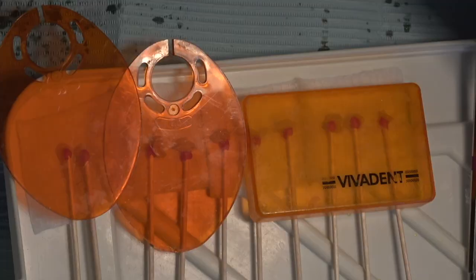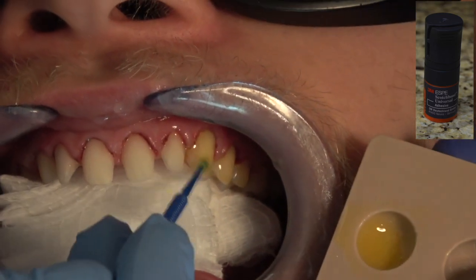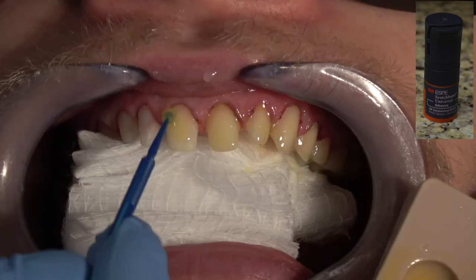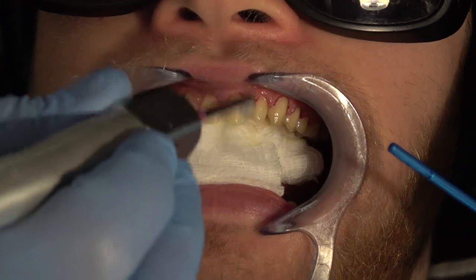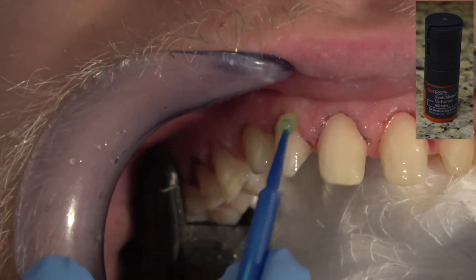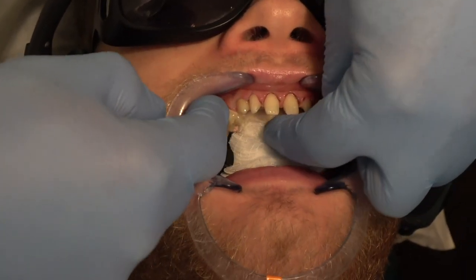Now, I've dabbed the teeth with a 2x2. The primer adhesive likes dampness. The primer is attracted to water. It's hydrophilic. So you don't have to blow them dead dry. Just kind of dab them off with a 2x2. You don't want to elicit bleeding again. And pile this primer adhesive on the teeth thickly. Just put it on there thick, and then you're going to blow it off again to get rid of the acetone carrier. So load it up, and then blow it onto a 2x2. So nothing wiggles on the veneer or on the tooth. And really load it up so you're sure the surface of the tooth is completely covered. Pop that floss through the bicuspid, because I haven't prepared all the way through the interproximal contact.